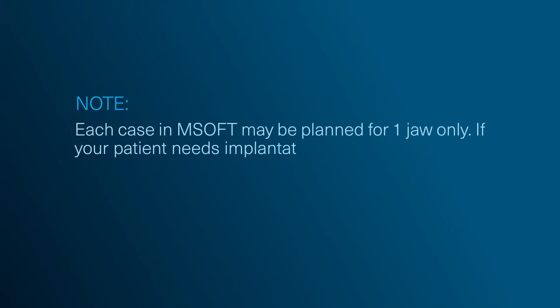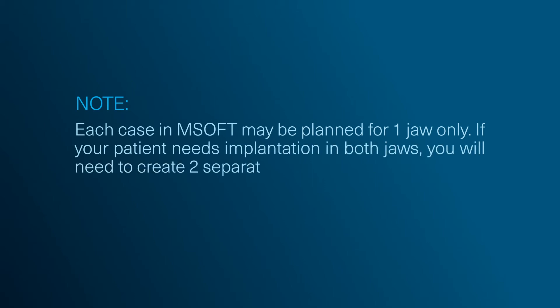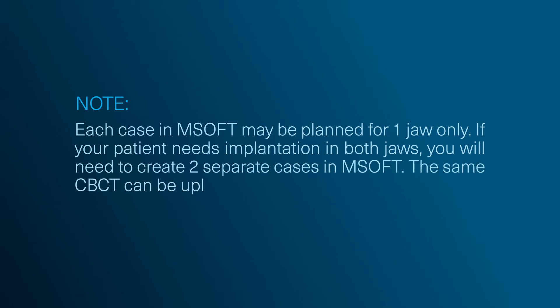If your patient needs implantation in both jaws, you will need to create two separate cases in MSoft. The same CBCT may be uploaded twice, once for each jaw.